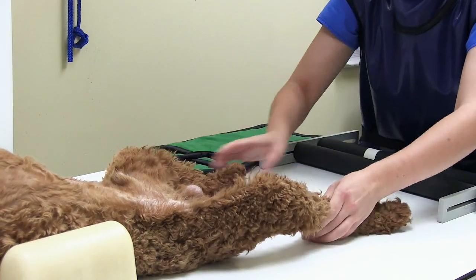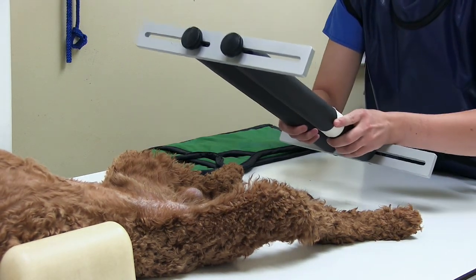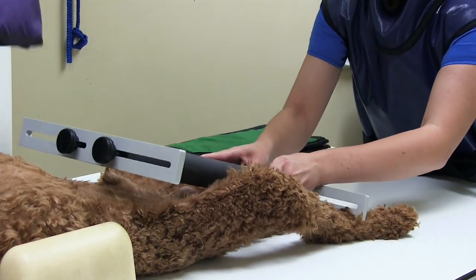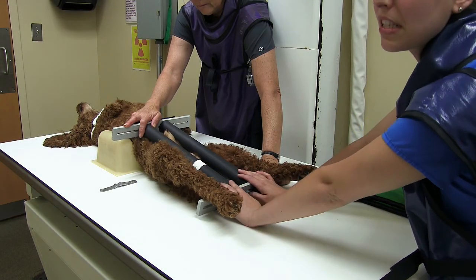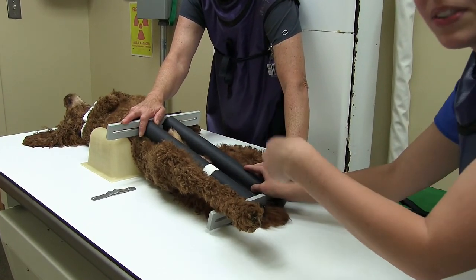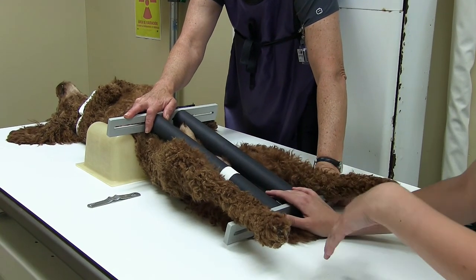The last shot, which is very specific to PennHIP, is called the distracted view. This tool is called a distractor — it is specific to the PennHIP procedure. It has adjustable bars made of foam with some PVC pipe on the inside, and you can move them to the width of the hips of the dog.